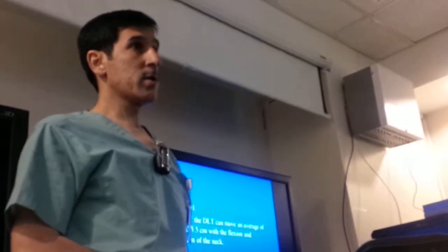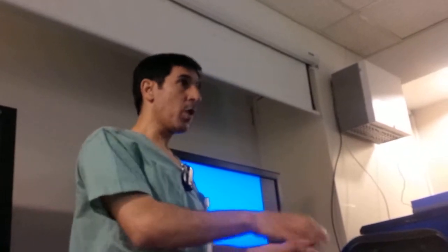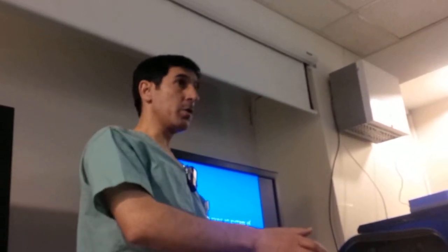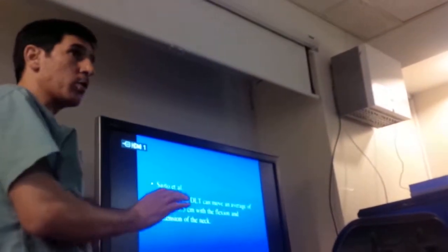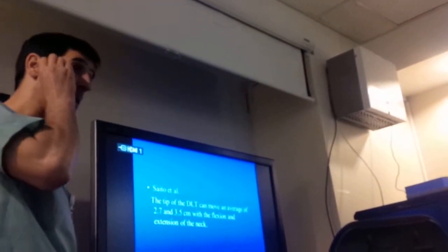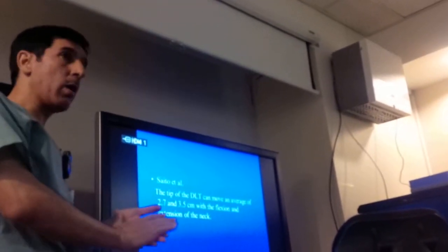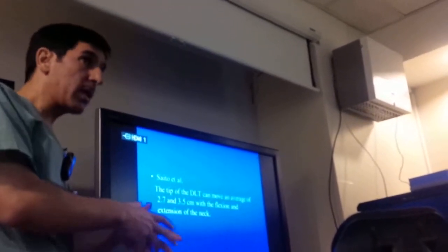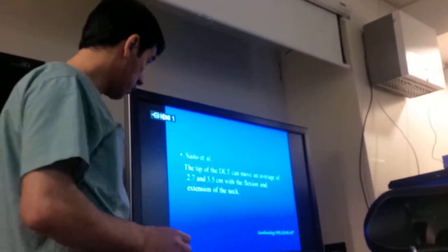Usually in 25% you have malposition after positioning the patient on the lateral side. And you have 25% malposition after confirming the position of the tube, because of the manipulation of the surgery, especially on the right side. So you have to keep the bronchoscope in the theater all the time, because anytime the isolation may be lost and the patient may become hypoxic. To confirm the position is the fiberoptic bronchoscopy.